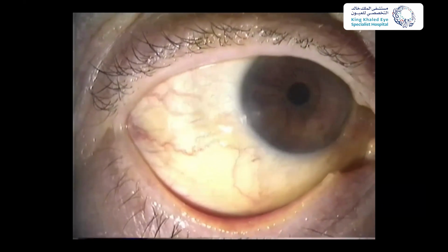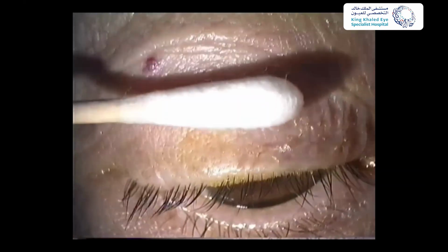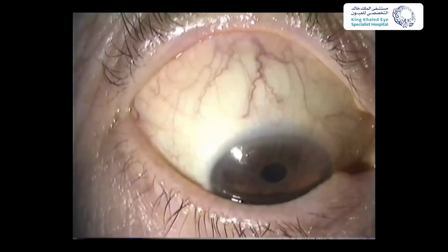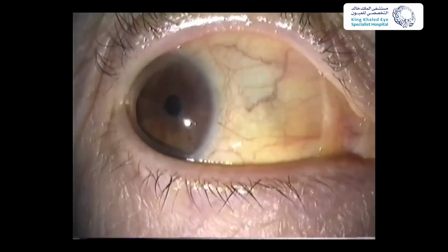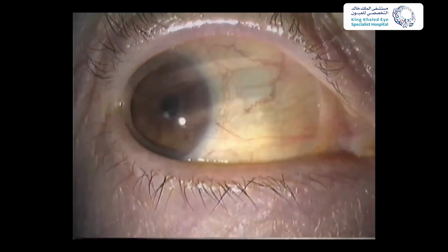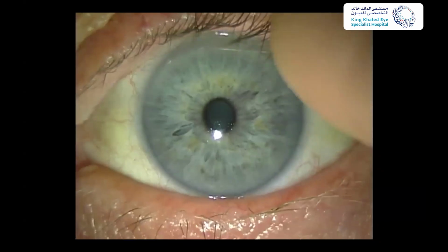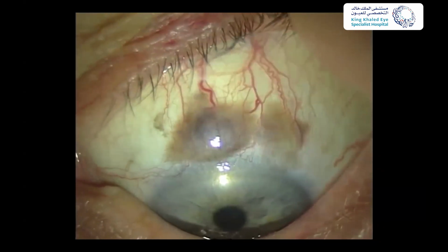Neovascularization with these fine vessels in the angle. Somebody whose eye looks pretty good, kind of red, kind of engorged vessels, might be on brimonidine. But when we put the gonio lens on, you can see blood in Schlemm's canal from high episcleral venous pressure. This eye looks pretty good too until he looks down, and when we look at his angle, we can see that it's completely full of melanoma.